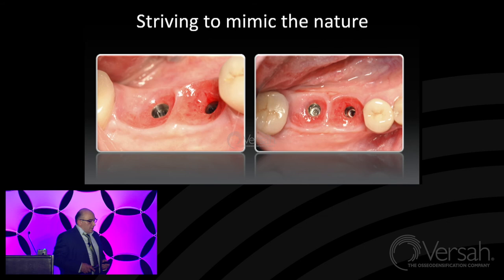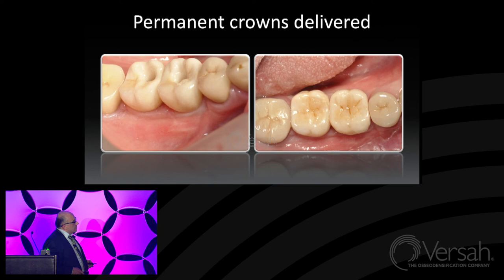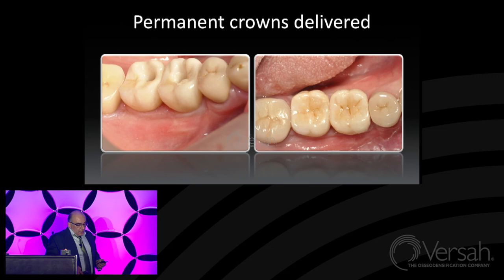And that's the permanent crown delivered. I think the view looks like natural teeth. Look at these prominences around the implant, around the definite crowns, around the final restoration. It looked natural, in my opinion. So that's the reason we spent three or sometimes four visits of the patient to the clinic, modifying the teeth every time and returning them, pushing the soft tissue, and creating this new emergence profile. This is the control X-ray.